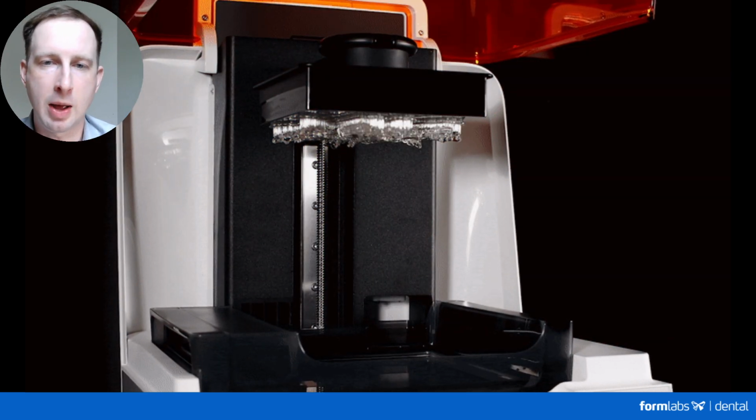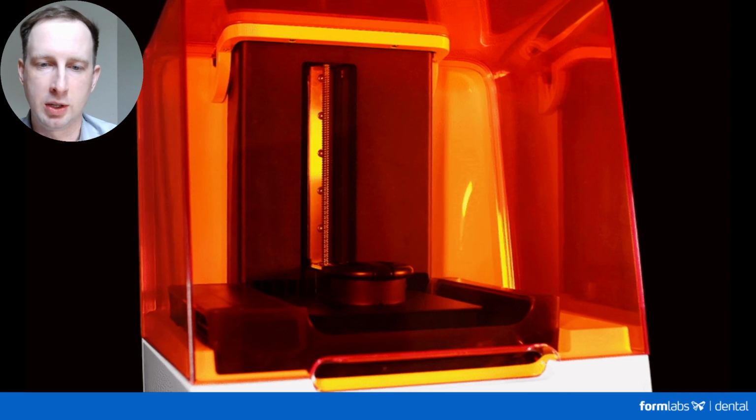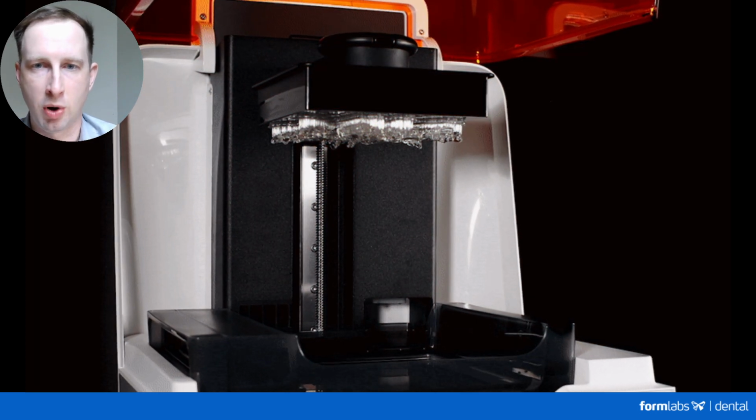This is a time lapse of some splints that are being printed, which I thought was pretty neat. But the printer literally uses light to photo cure these resins and make physical parts out of them.